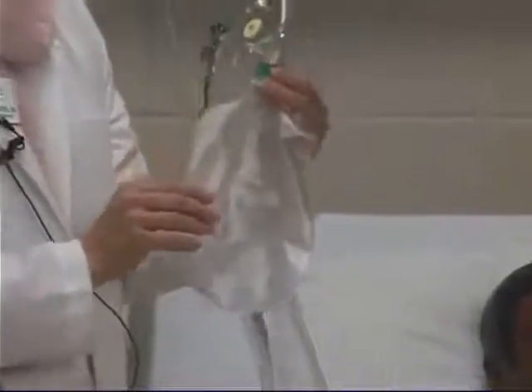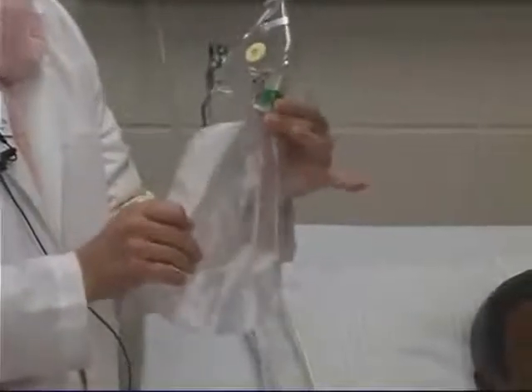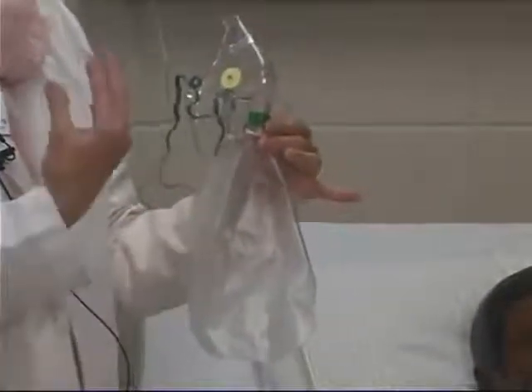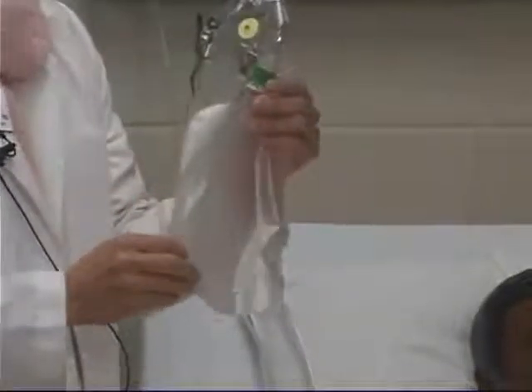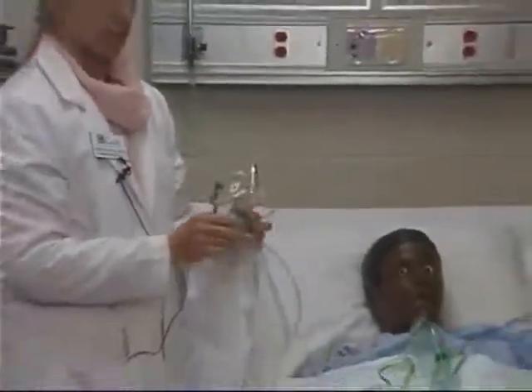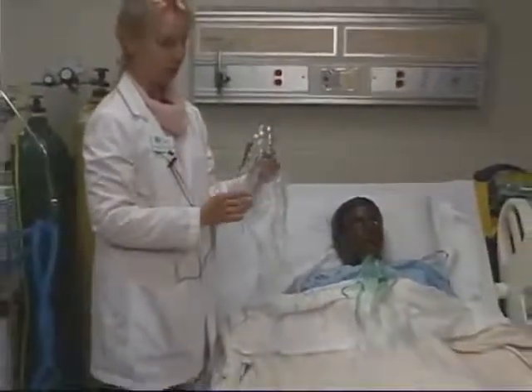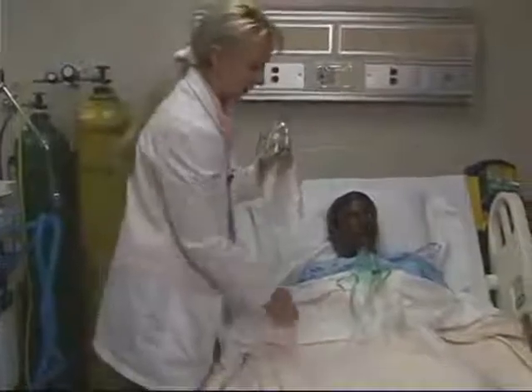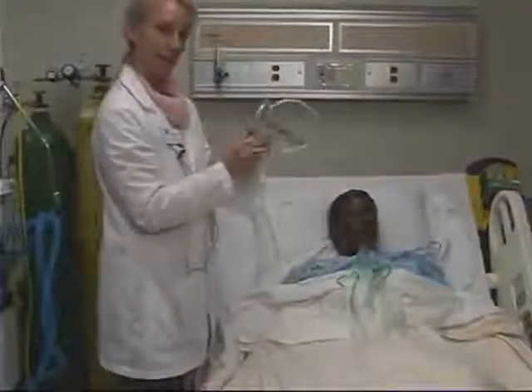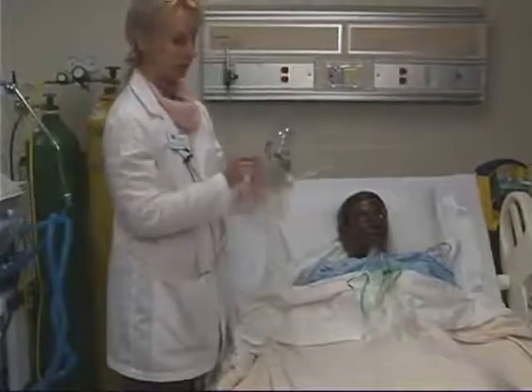However, with this system, this bag is going to contain oxygen. So the patient, when they inhale, is going to be receiving a higher percentage of oxygen. This oxygen delivery device can deliver anywhere between 60 and you may read up to 100% of oxygen to the patient. However, with any type of a mask system, it's difficult to achieve 100% of oxygen delivery to the patient.